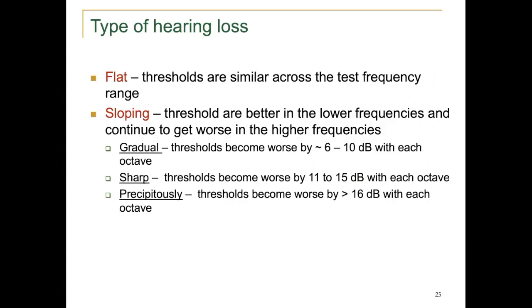So there are different configurations or shapes to these audiograms. We can have a flat shape or a sloping shape. And with sloping shapes, there are subcategories, and each one of these sloping configurations has its own criteria.